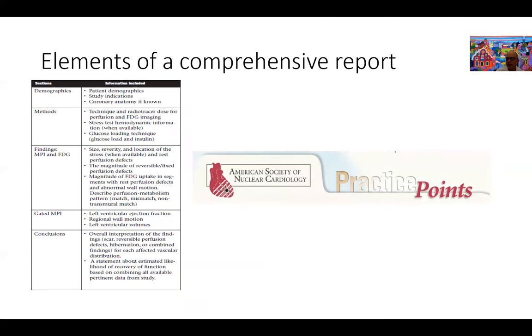Now finally we get to the point where we have to report the findings we have. We start with the same pattern we've done in all these images: we start with demographics, the coronary anatomy if known. Preferably you should know the coronary anatomy before you embark on assessing hibernation so you know if you have coronaries that are suitable for revascularization. Then we write here what we've done—this is all for QA—what dose of FDG we used, what was the blood sugar during the time, did we achieve glucose clamping, was the patient diabetic or non-diabetic.